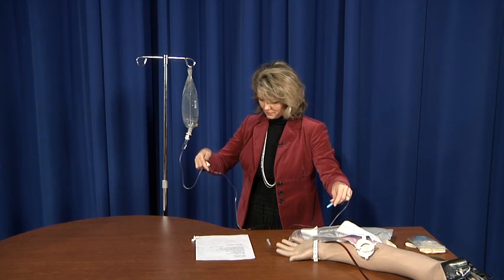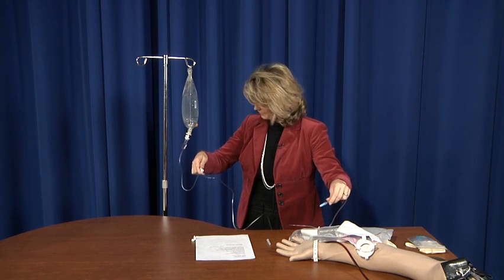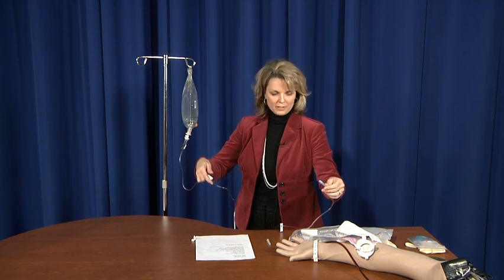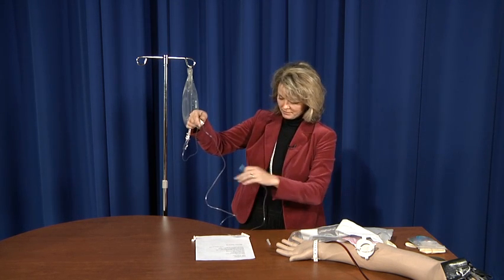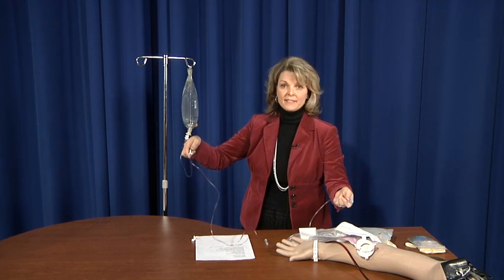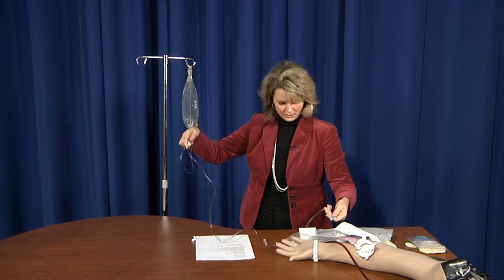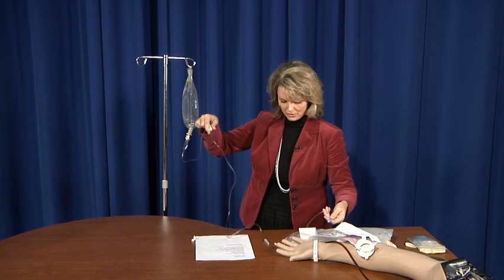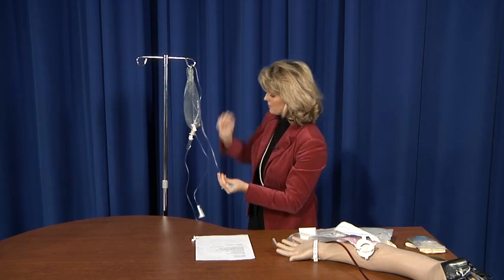Once the fluid has gone through all of the tubing, there's no air. I still have the end of this on. If I should take it off, it would go a lot faster. There's one little bubble here, and that's it. So when we clear the line, we're going to clear all the way to that second bubble. We don't want any air in the line. You can see dripping. So now I'm going to turn off my fluid. And that's it. We're ready to initiate the IV.